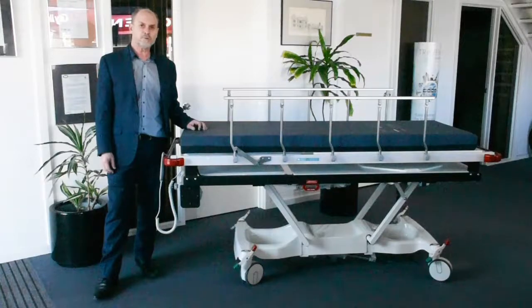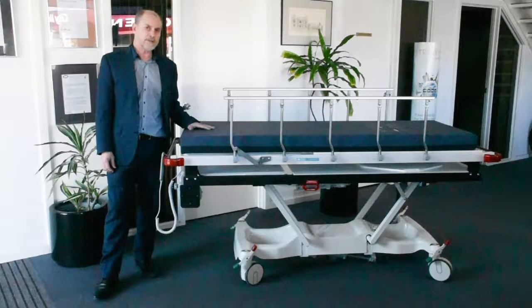Hi, I'm Chris from Surgical and Medical Supplies. Here's one of the three trauma barouche models in the ModCell range, which are made here in Australia. This is the Contour Porter X.